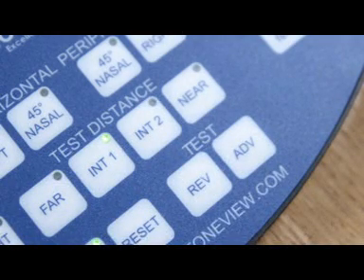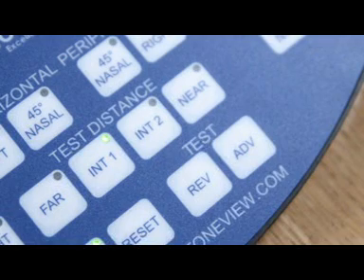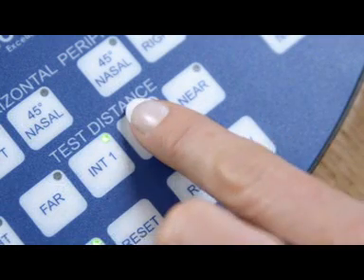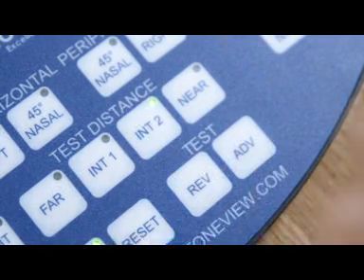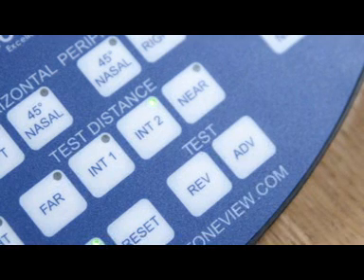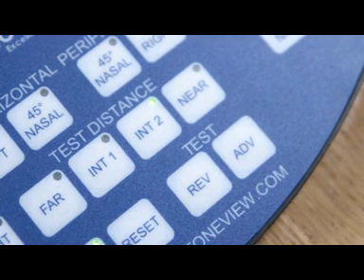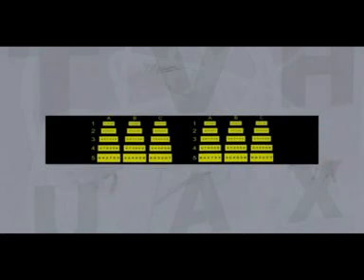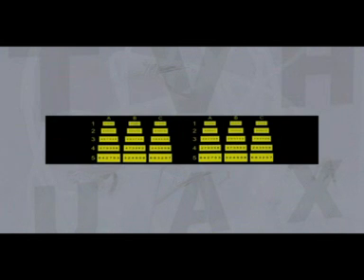Press INT2 on the control panel to move on to the next test. This will activate testing at an intermediate distance of 60 cm. The test has the same structure as tests F1 and I1 and should be conducted in the same way but reading down column C.